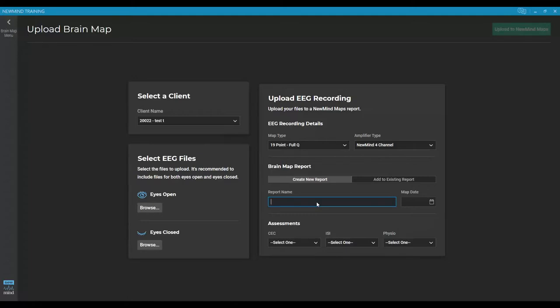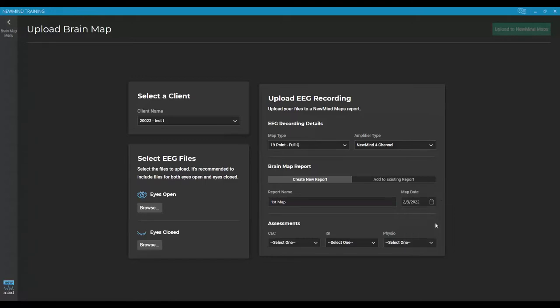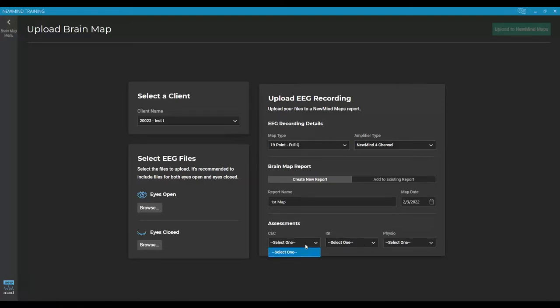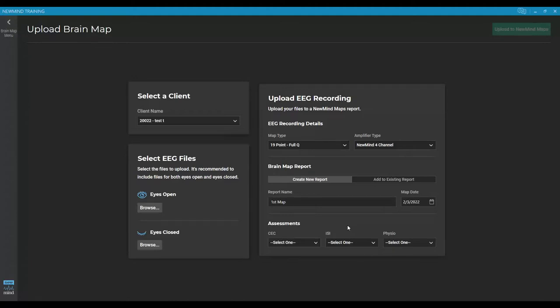You don't have to do it that way. You can name these however you want. But I will show you when we get into the database where this name is going to end up showing up, so you can understand a little better and choose your names properly. So this is the first map. They want to know the map date. So we can click on the calendar, select the date. And then if they had completed any of the surveys, which they should have, you can select those so it ties those into this map. Keep in mind, we generally have them fill out new surveys every time we remap them. So pay attention to the dates if this is their second or third map, so you can get the right surveys for the right map.